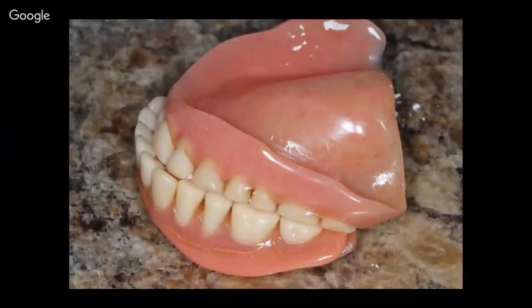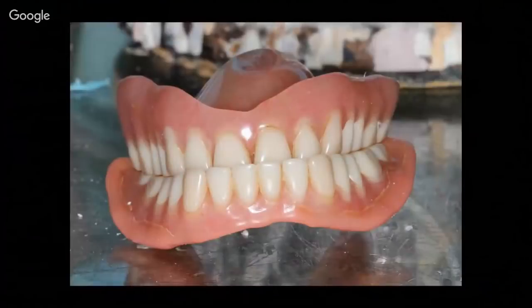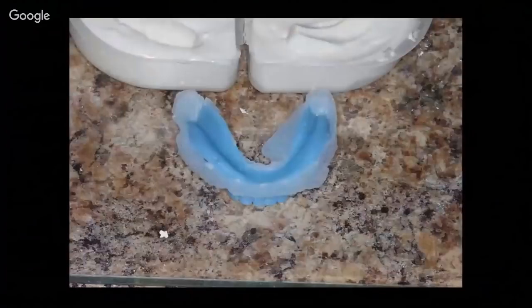So here's the situation: classic combination syndrome. The patient has worn these dentures for years and years, and they've kind of worn the teeth down in the posterior. They got into a pseudo class 3 bite, and in order to get the teeth to fit together, you can see that the patient's now in the pseudo class 3. Everything is collapsed. The posterior ridge on the mandible has all resorbed, so this is not an easy situation to treat. Okay, and yet she does want to preserve the tissue fit and the borders of this denture.